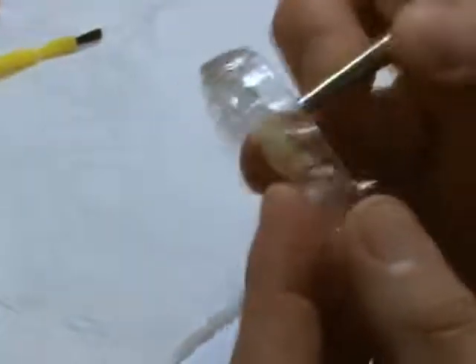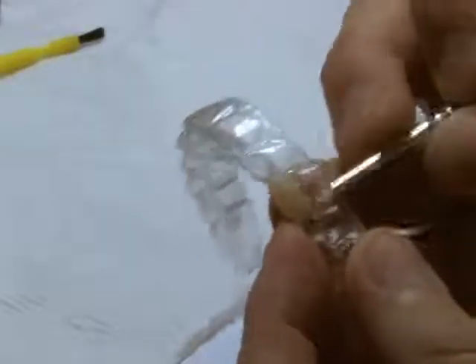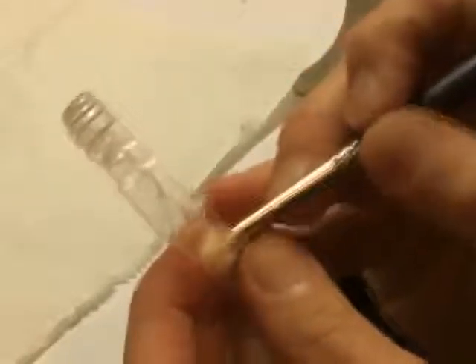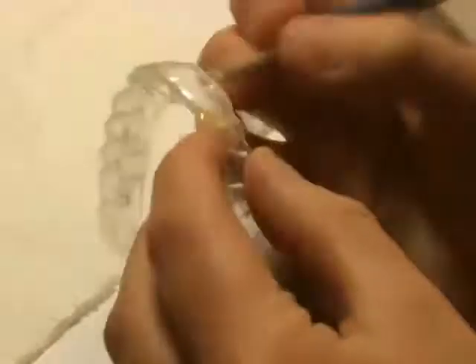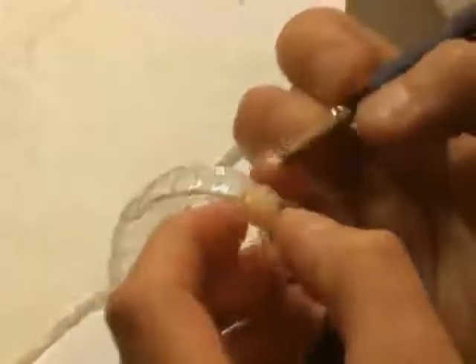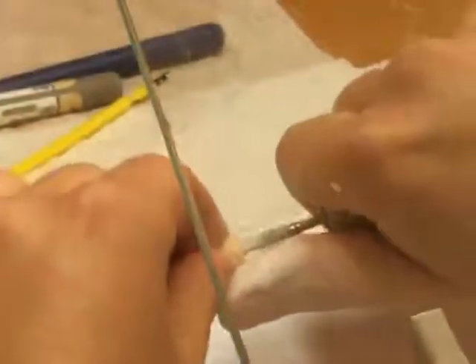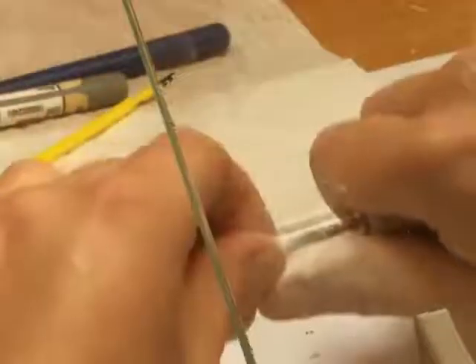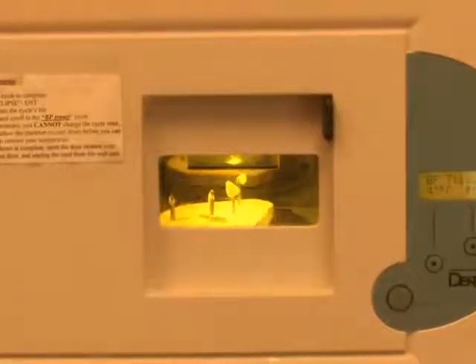A shade is then selected and allows us to use the same shaded acrylic to then fill in the area of the missing tooth. And this can be done with packable resin or composite material. So this really allows us to create a shell of adequate color. And it's very important, once this is light cured, that we hollow out the denture tooth to make sure that it is not loading the implant abutment at all during the healing phase.